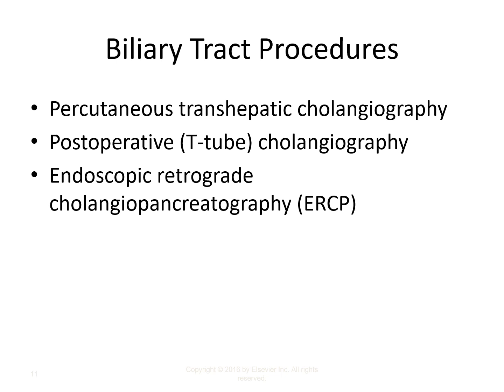It's a rare occurrence with a laparoscopic procedure that we see much T-tube cholangiography anymore, but it does still exist, so the technologist should be familiar with the procedure. Typically, the T-tube has to be clamped for a certain duration pre-cholangiogram, and then you inject the contrast through the T-tube drain. Okay? And then you do another clamping so that the contrast does not drain back out of the T-tube during fluoroscopy.